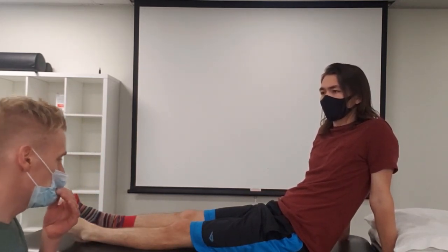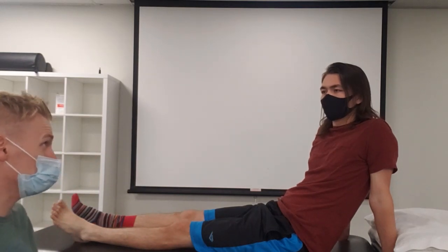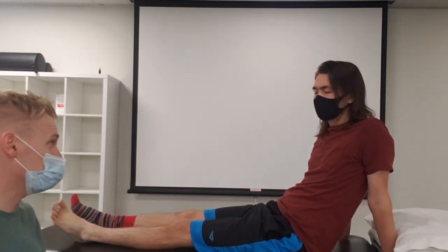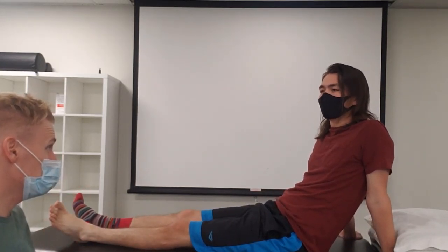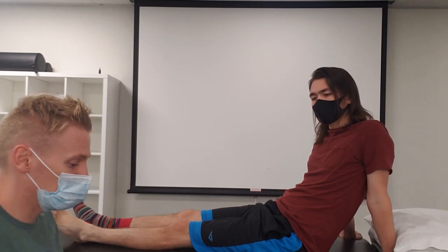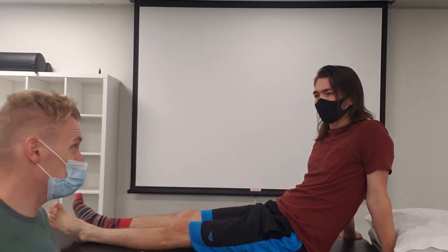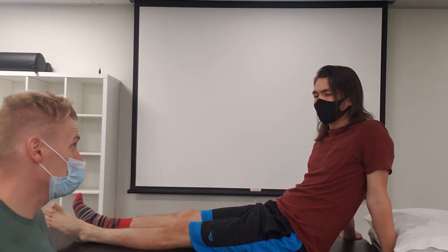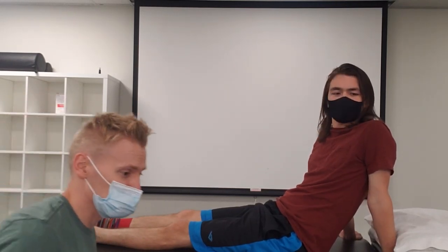heal. So the type of ultrasound we're going to use, because you're in an acute stage, it's only been 2 days since your injury, is a non-thermal ultrasound. And basically I'm just going to use a medium and kind of have a circular motion around that area, and it's going to help with promoting that healing. So does that treatment sound okay? Are you comfortable with that? Yeah, that sounds fine. Okay, perfect.